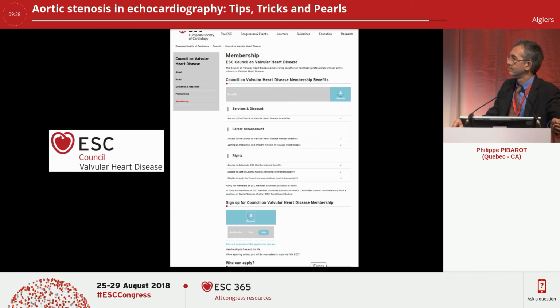Philippe, I think you mentioned very nicely the components of where errors could go. The other one I'd like you to mention is the location of pulse Doppler, because the TVI just below the aortic valve is also crucial, and a small error really can be quite misleading. No, absolutely right. Given the time, I skipped the slides, but I agree.